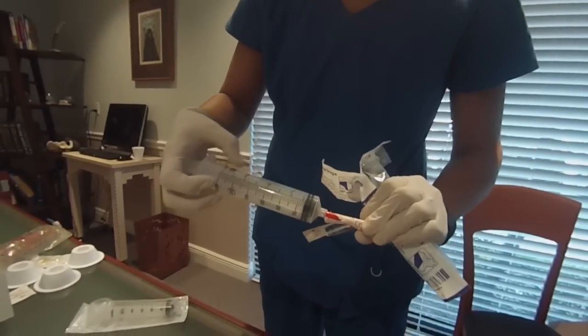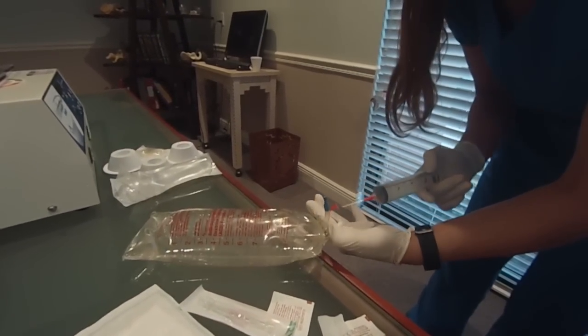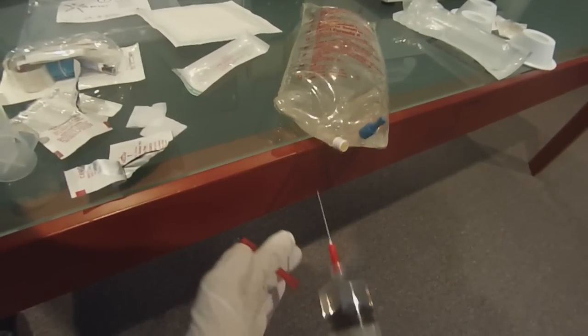Using the components in kit number one for blood collection, connect a red blunt fill needle to each of the 60ml syringes. Alcohol swab the ACDA port and insert the blunt fill needle into the bag. Collect seven mLs of ACDA into each of the 60ml syringes.